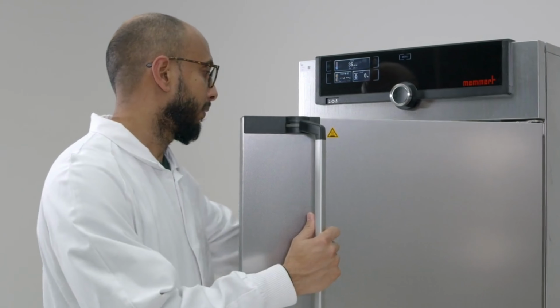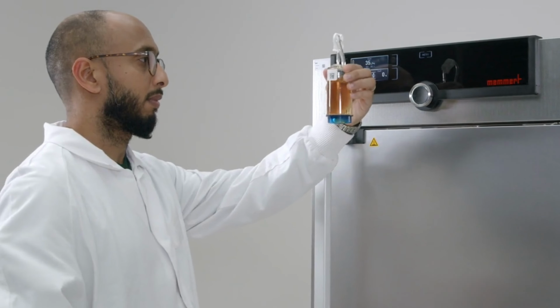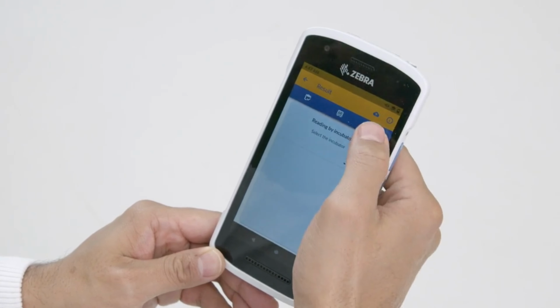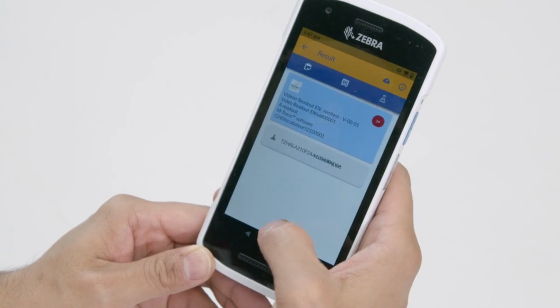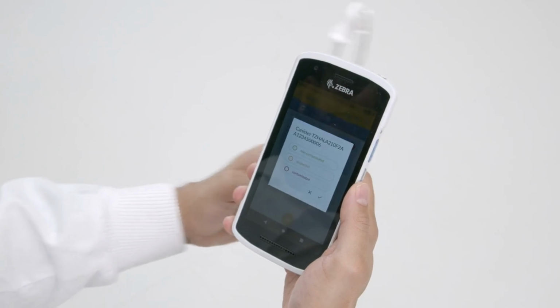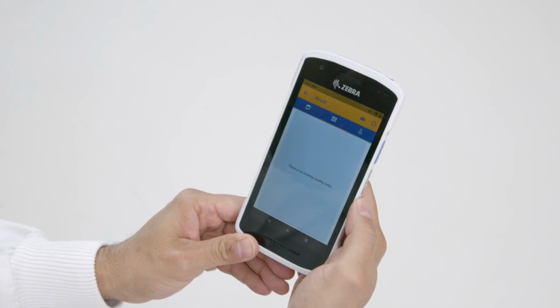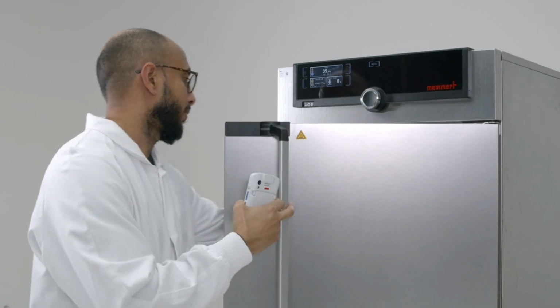Sample examination. To do so, the operator must first scan and identify the sample to be examined. Predefined parameters and values of the examination results can be entered into the M-Trace app conveniently, thanks to the M-Trace mobile device and the offline examination functionality. All this can be done from anywhere in the facility.